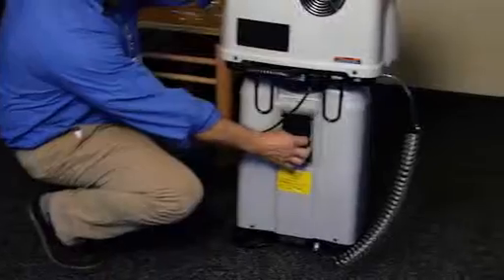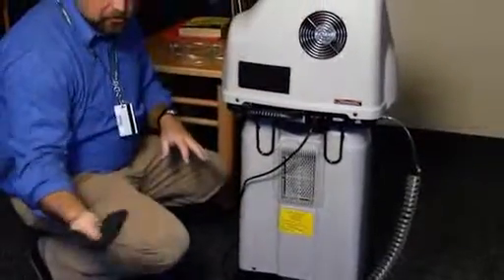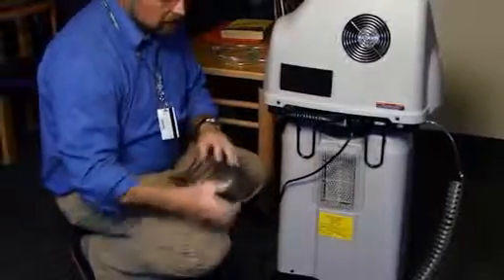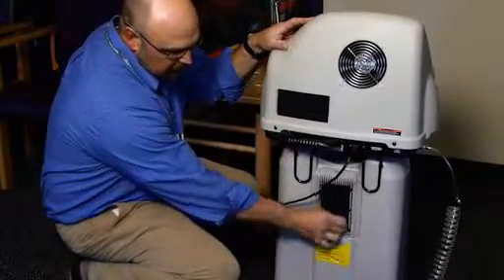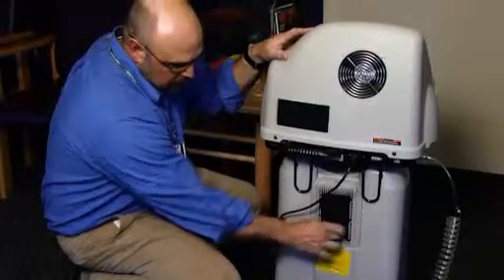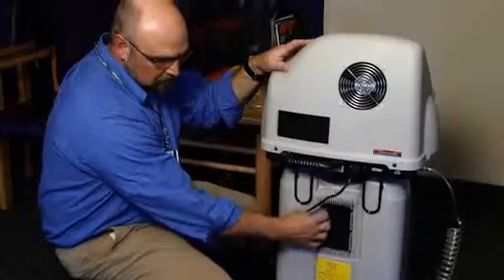And the bottom one is the same thing. It's a pinch pull filter. You pinch it, pull it out of there, do the same thing, squeeze it out, and place it back in. It's simply tucking it back in there. And again, it catches the dust and keeps the machine and the oxygen coming to you cleaner.